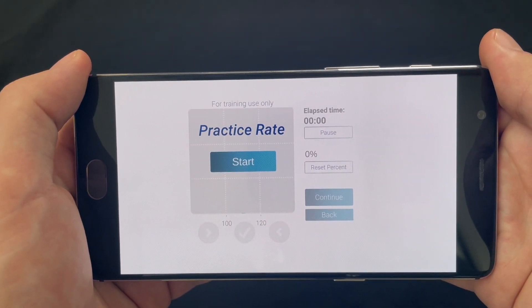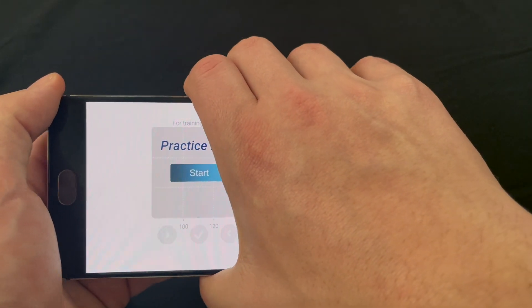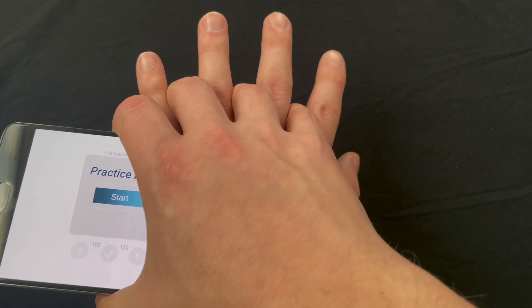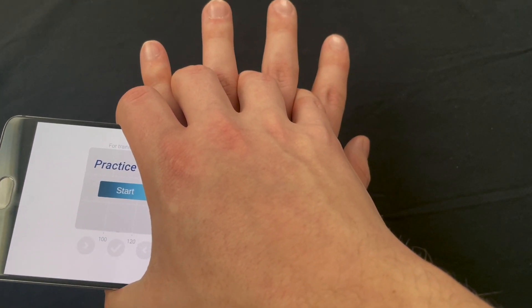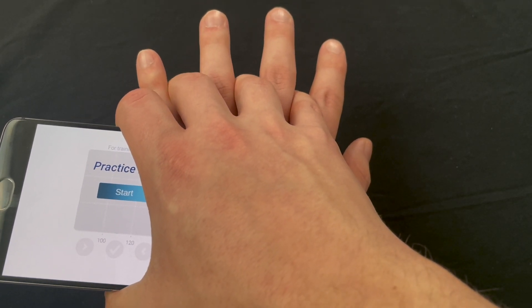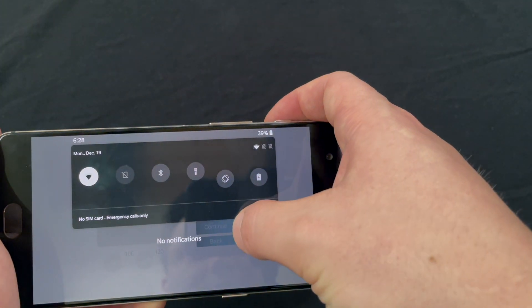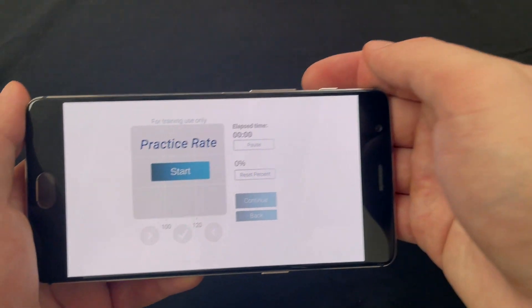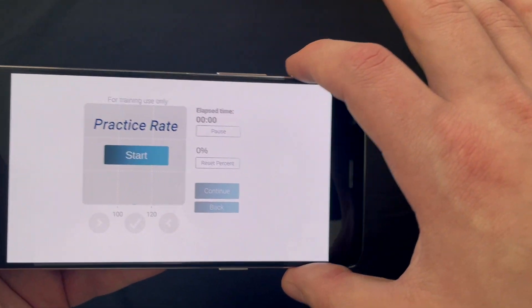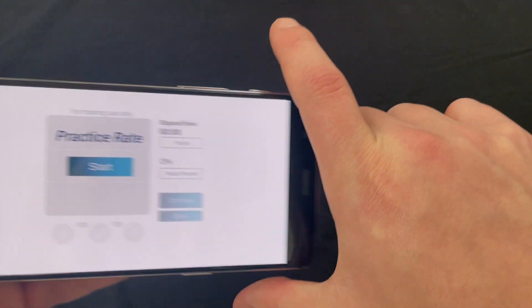One of the most common mistakes I see is grabbing the phone too far towards the center and simply clamping it between the palm of the top hand and the back of the bottom hand. While this keeps the phone in place, I find it to be uncomfortable and sometimes even painful. It also increases the probability that you'll accidentally touch one of the buttons or trigger other functions you don't want while practicing. So again, you want to grab just the top bit of your phone — maybe the top inch or so, inch and a half on a bigger phone — using just your thumb and forefinger.